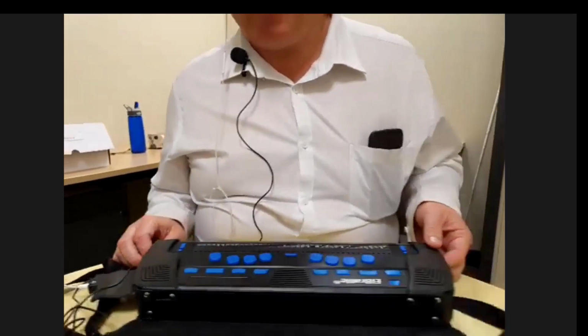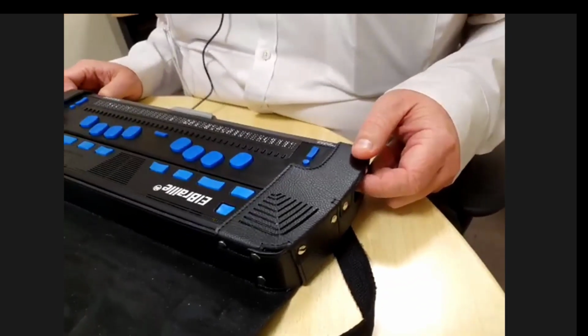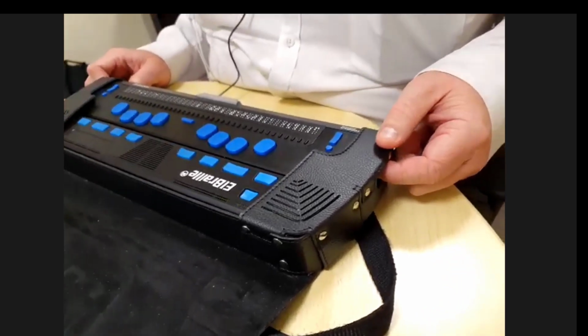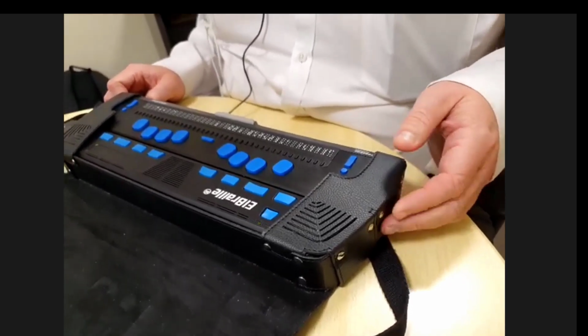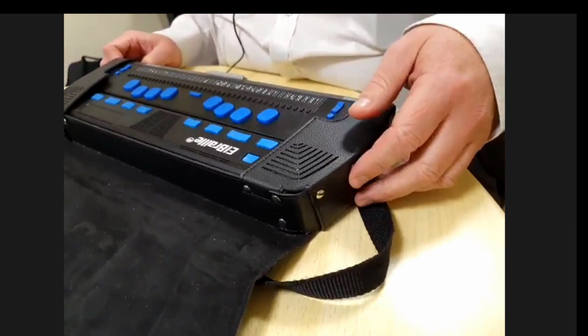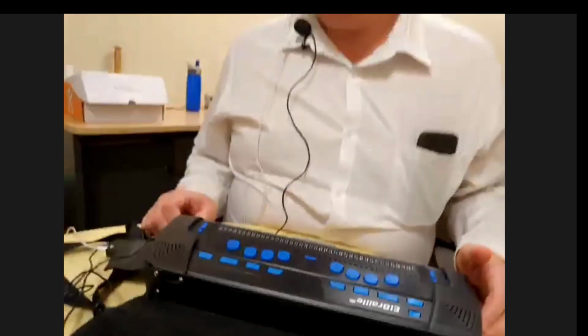On the left-hand side, we have a lever which we can pull out to separate the Focus 40 from the Elbraille docking station. I would have to take it out of the case to demonstrate that, and I'm not going to for the moment. We also have an SD card slot as well. There's also a 4G SIM card slot. So the device does have an LTE modem, and I'll talk a little bit about what that's for in a moment. That's really the physical description. On the front of the device, there is a small grill to accommodate the inbuilt microphone as well.